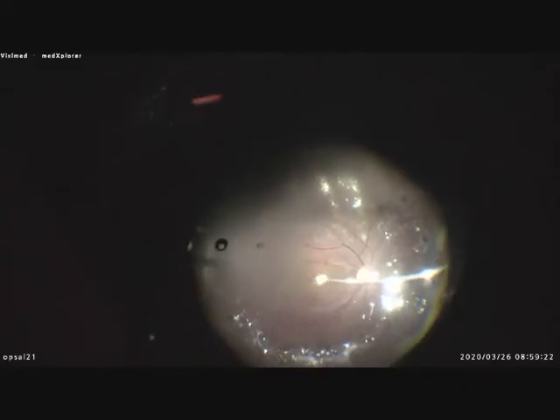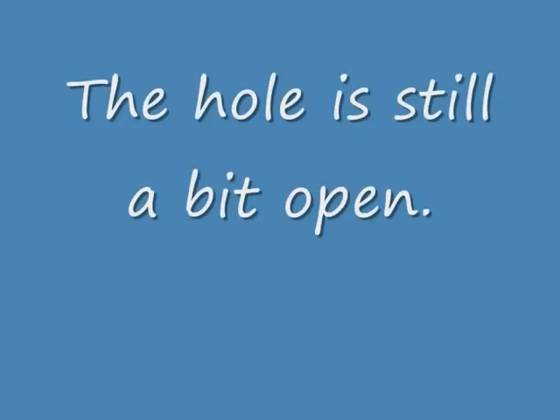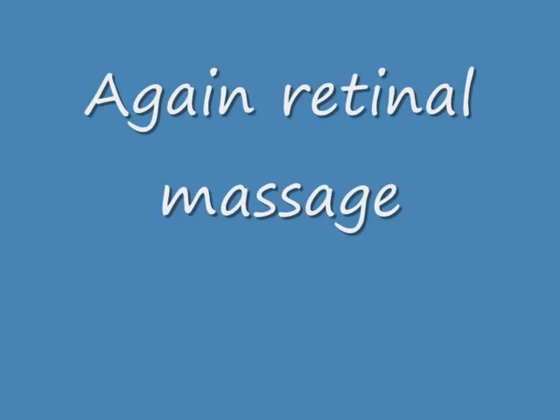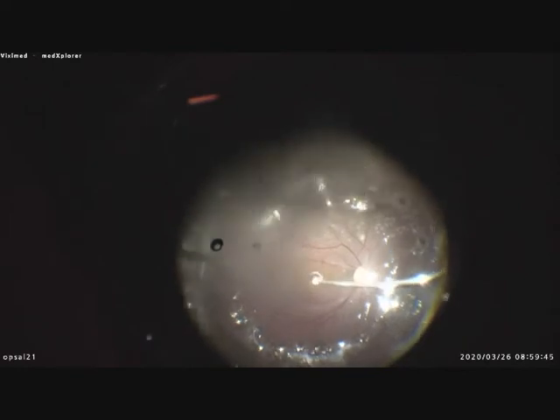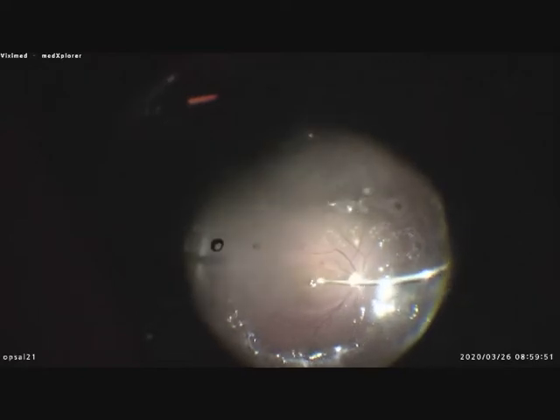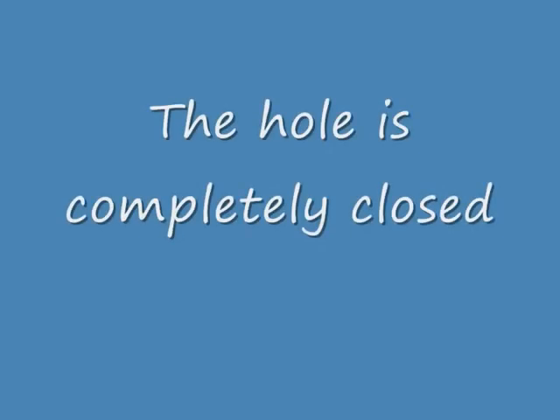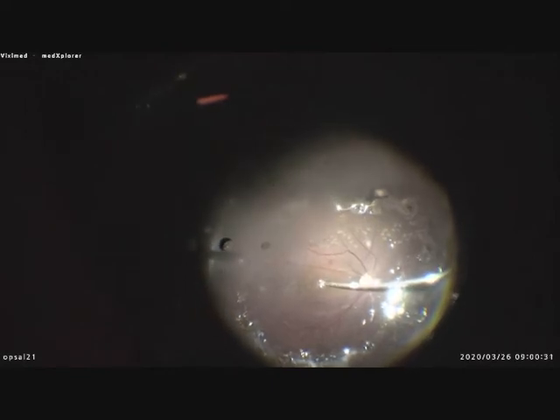There is a lot of fluid because it flows down the retina towards the macula. You can see the hole is still a bit open, and now the hole is completely closed. I wait again one to two minutes.